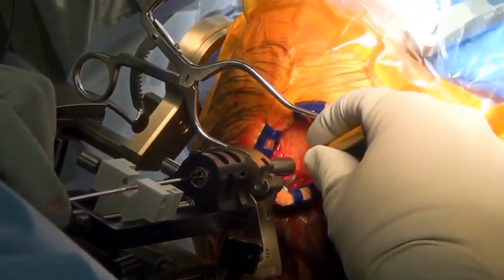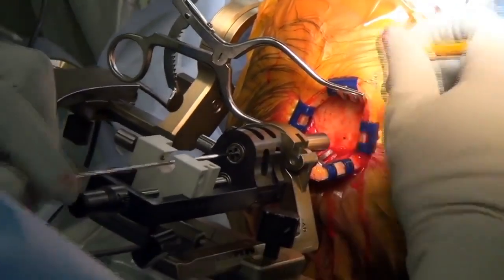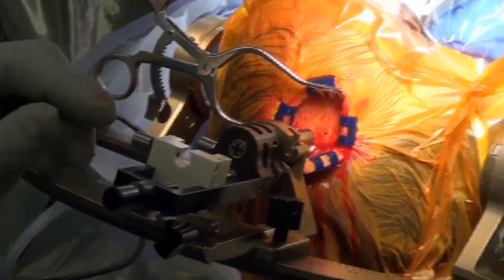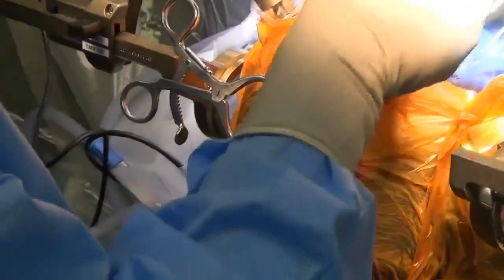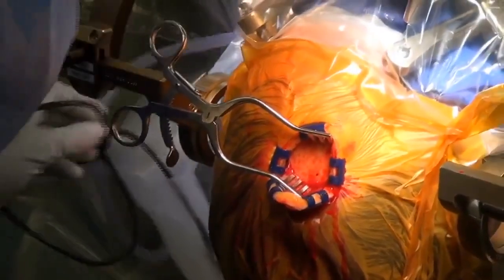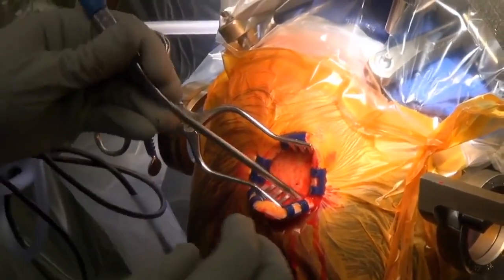And the goal here is just to really make sure that once we're all the way through, we're entering where we want to enter, that we're not missing it. Okay, let's see the suction and the drill. Yeah, straight to periphery.